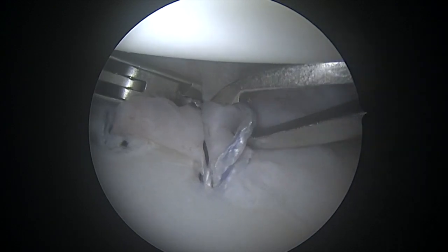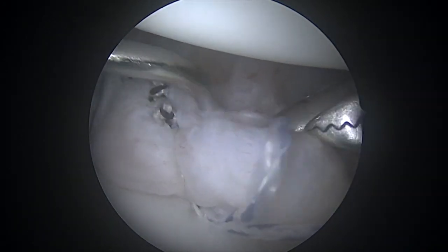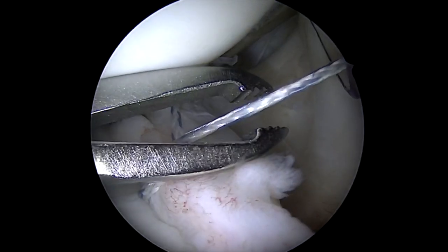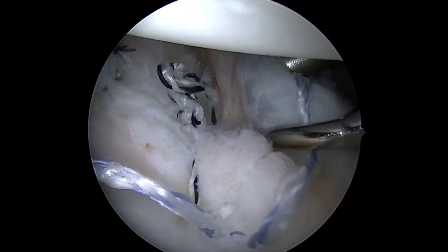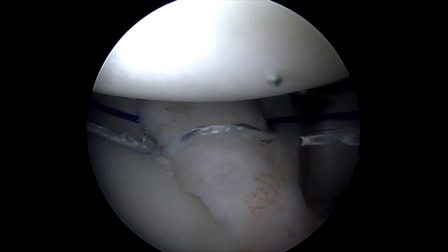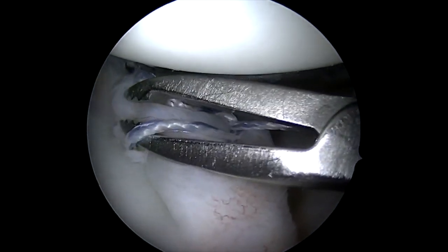As I come in here for the second one, you're going to notice that as I'm trying to get it perfect, I'm not able to bring the spectrum into the exact position I want. I show here piercing the capsule with the spectrum, and there's a sped-up section of me trying to get this perfect. If I can't get it exactly where I want it, I'll try coming from the other side. We'll use our grasper to reorient our sutures and bring that curved suture hook in from the other side — and now I can get it exactly in the right spot. This surgery, like all the surgeries I do, I'm very specific about getting everything exactly the way I want it, and we'll use many strategies during surgery to try over and over again until it's perfect.